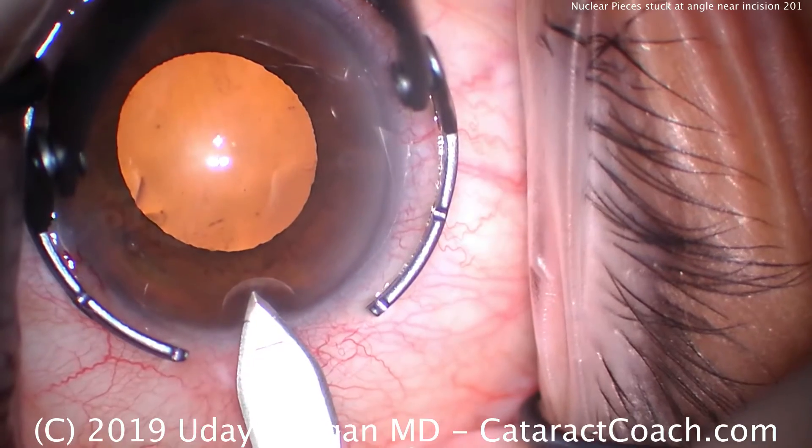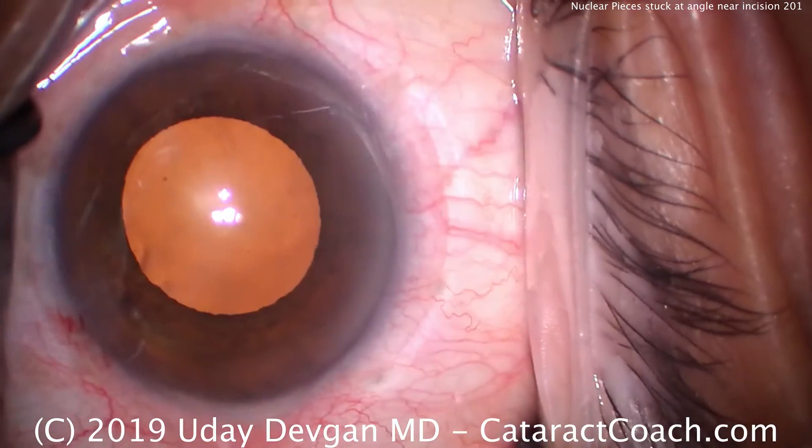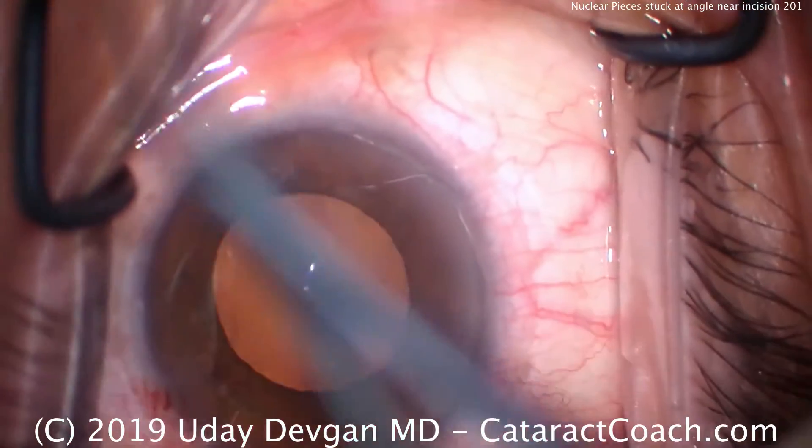It's a reasonably dilated pupil, not the best but tolerable. We make a single plane incision there, temporally. This is the left eye, and we're sitting in the temporal position.